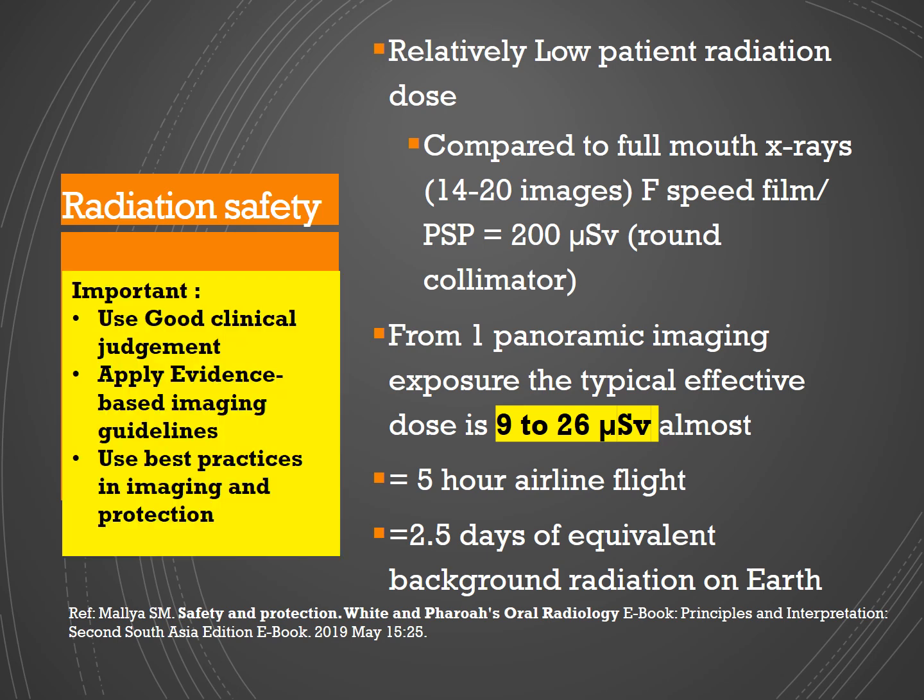So, what is important to understand is using good clinical judgment and applying evidence-based imaging guidelines. Just because we have all of these advantages in panoramic radiography, it doesn't mean we use it routinely to replace the intraoral periapical radiographs. It's important to read through and understand best practices of imaging as well as protection.